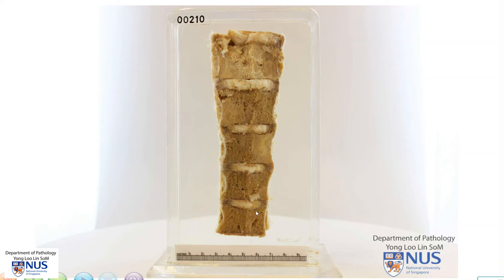In summary, this is a segment of the vertebral column that has been cut or split longitudinally and we can see several fleshy, tan areas within the vertebral bodies, which represents metastatic carcinoma. The diagnosis here is metastatic nasopharyngeal carcinoma.